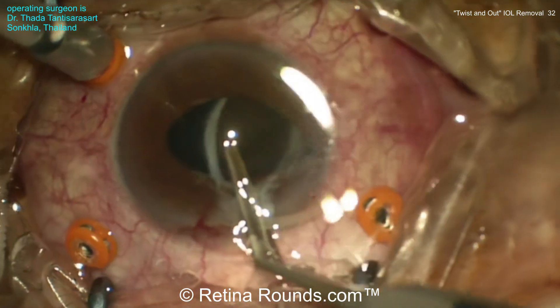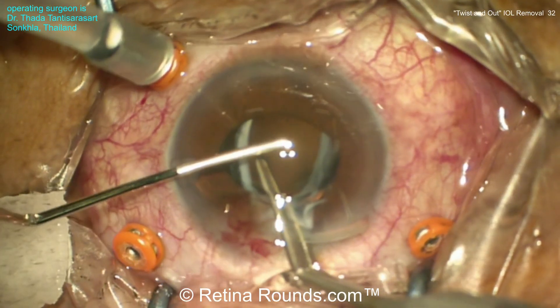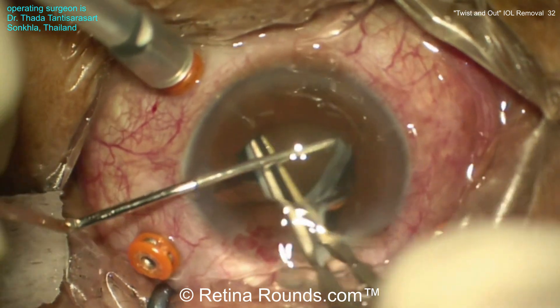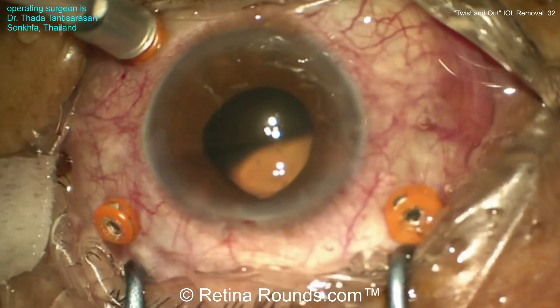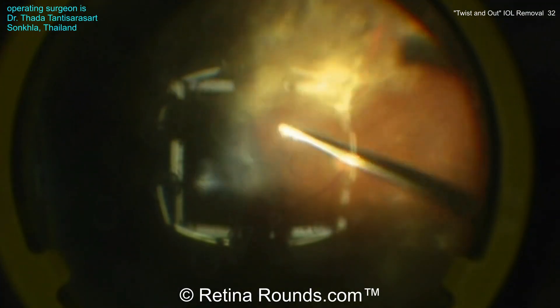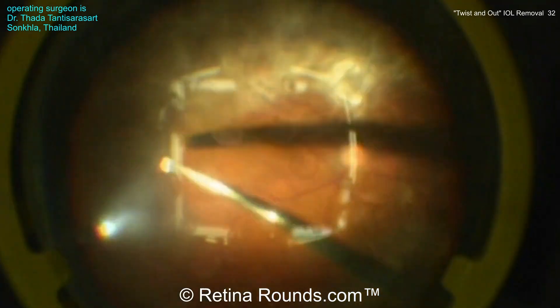Now a McPherson forcep is being introduced, and through the side port, a spatula is being used to protect the endothelium. Using the McPherson forcep, the lens is then rotated so that it's folded in half and then pulled out through that clear corneal wound. Some viscoelastic is put in the anterior chamber to reposition the iris that's prolapsed out through that clear corneal wound, and now the vitrectomy can be continued.